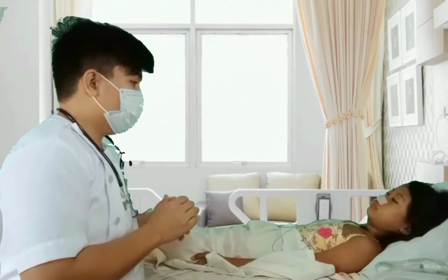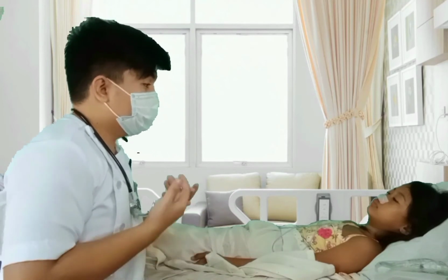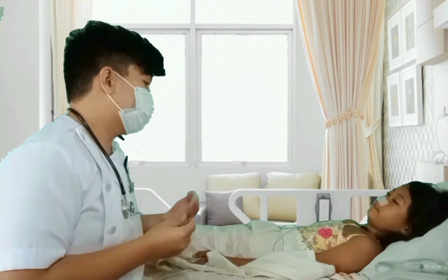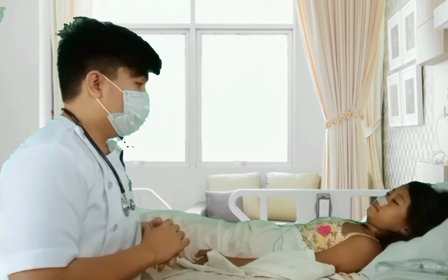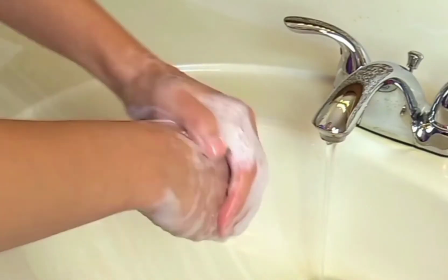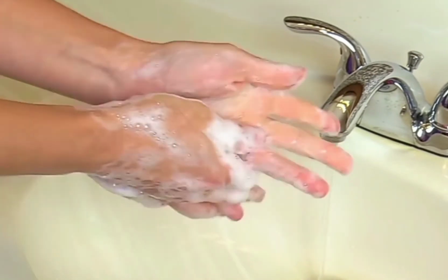Step 1. Explain the procedure. Discussion and explanation help allay anxiety, encourage patient cooperation, and prepare the patient for what to expect. Step 2. Perform hand hygiene. Hand hygiene deters the spread of microorganisms.